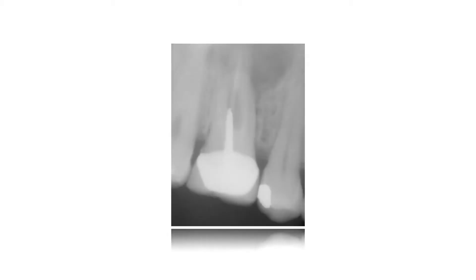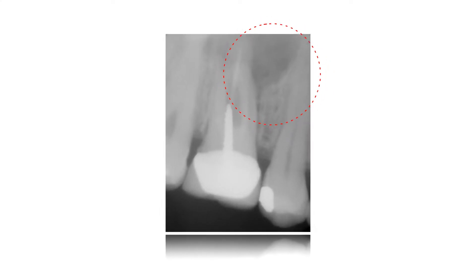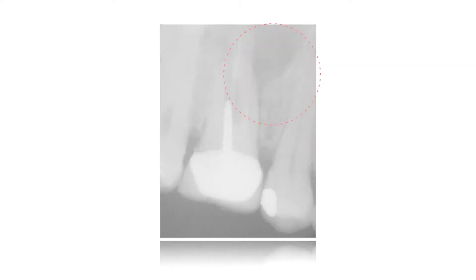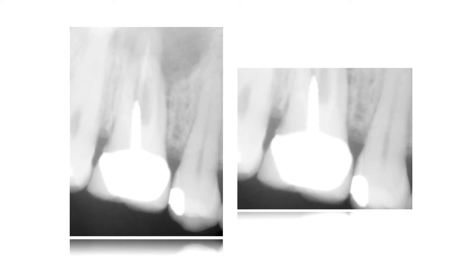Speaking about microscope-guided endodontics, we will start with a clinical case where the patient was in terrible pain with severe swelling. She came to us and through examination, we established the diagnosis of incomplete root canal therapy and a huge lesion surrounding the tooth. This lesion was related to the poor root canal therapy, which might have one or multiple sources.